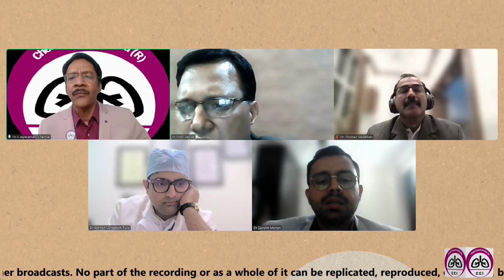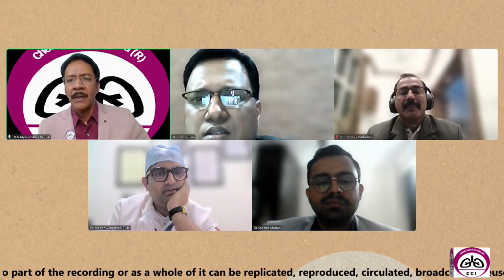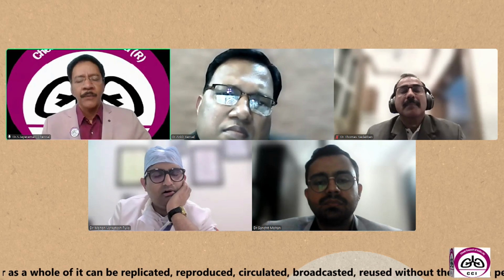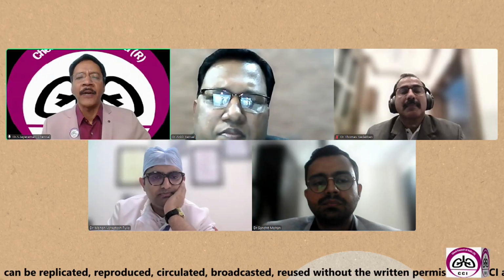Ankit? The 5 and 6, this is paraaortic, subaortic. Can't be sampled by EBUS or EUS. Yeah. They require either extended mediastinoscopy or VATS. Yes. Sample level 5, level 6. Fine.